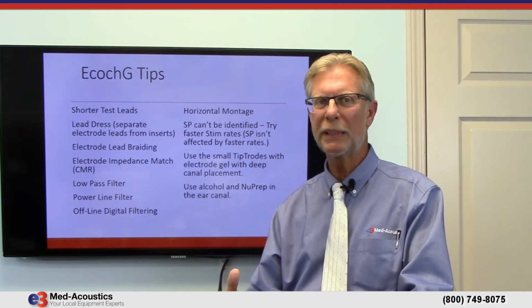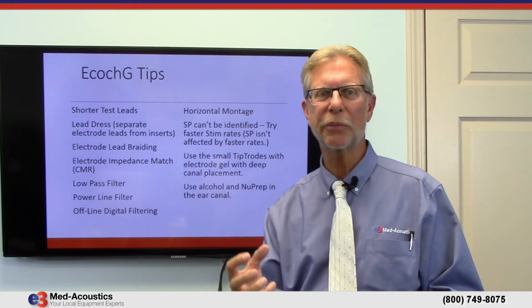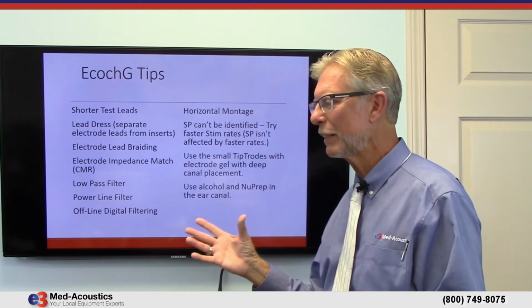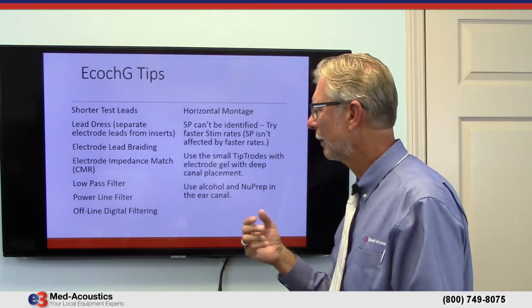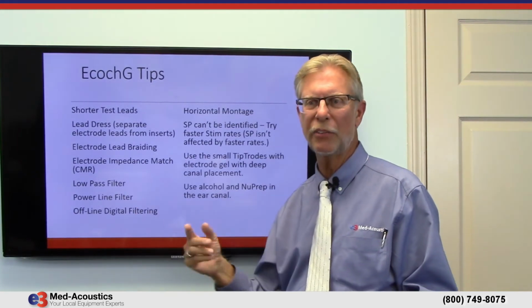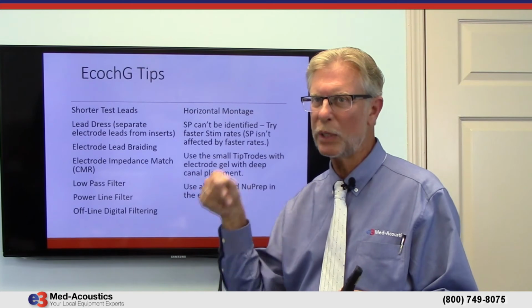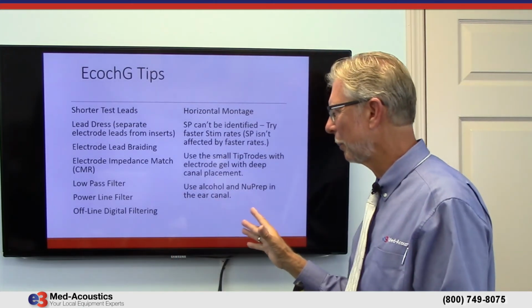An outlet strip. But it's a special outlet strip that has an AC line filter in it. And it makes a big, big difference where interference is coming through the power system of the building, okay? So that power line filter is excellent. It costs you about $129, and in many, many cases, we plug the equipment into that, and presto, interference disappears, okay?